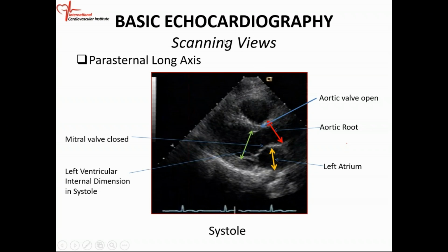The left ventricular outflow diameter is measured just a little bit in front of the valve, a few millimeters, from the blood tissue plane to the blood tissue plane, with a perpendicular line. I don't want to see any slanted line.